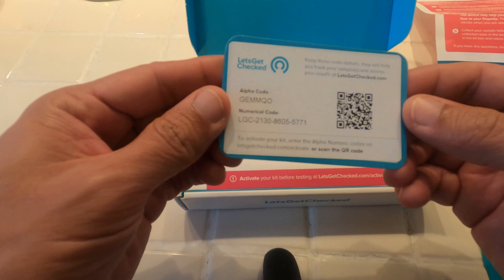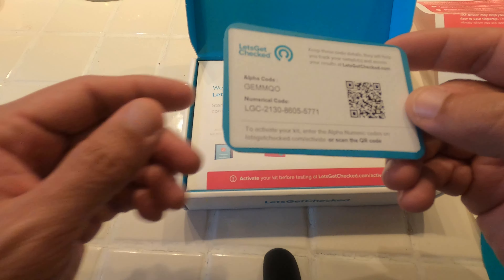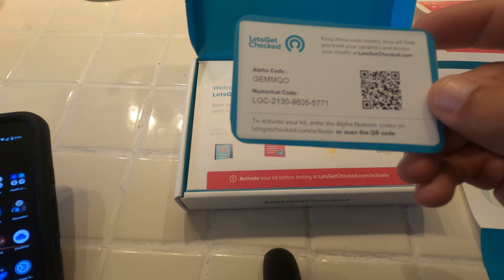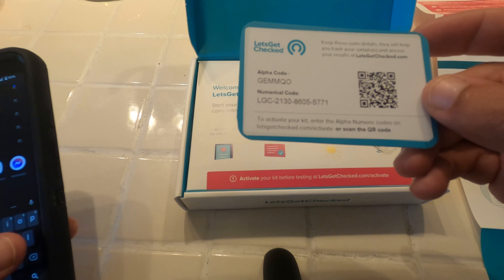The next thing we have here is the code, and what I have to do now is activate the kit. You go to letsgetchecked.com/activate to do that.